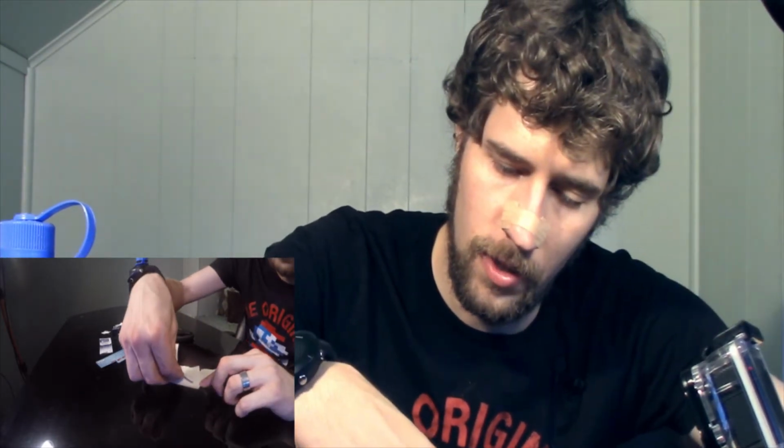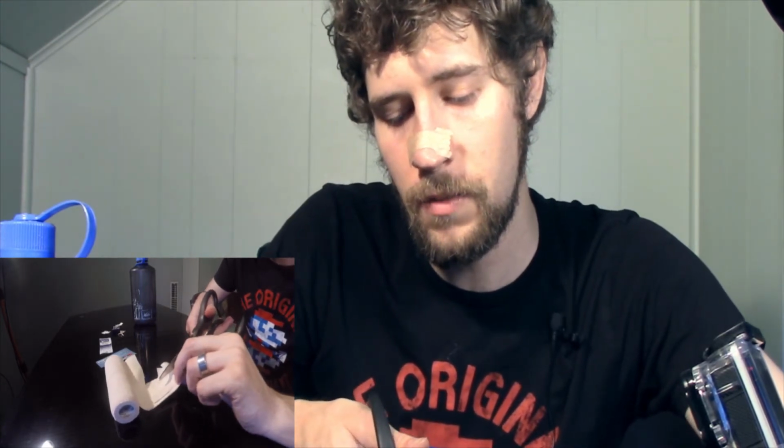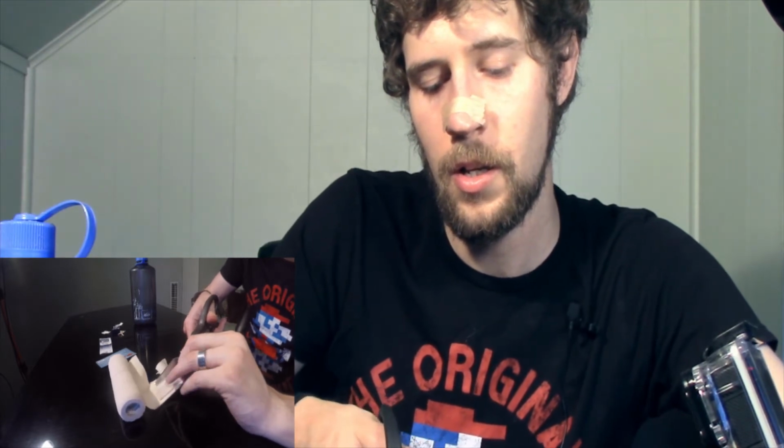Next, this is the last major step. You want to measure out your bandage by the size of this. I've got a pretty big nose, so I typically go maybe an inch, maybe half an inch beyond the bridge piece. You put the bridge part onto the bandage, pull the bandage part out. There, pretty simple. Cut. And it really only needs to be as wide as your nose is long. Honestly, it doesn't even have to be that big. You could even make it just as small as the bridge piece if you wanted to minimize how goofy you look at night.